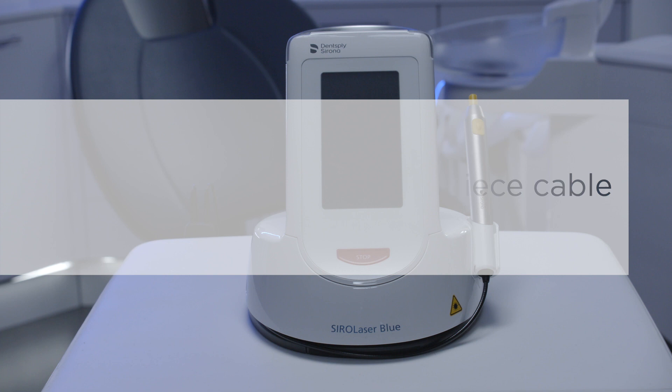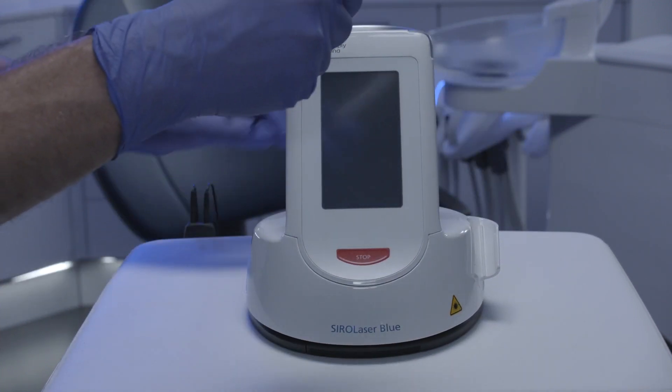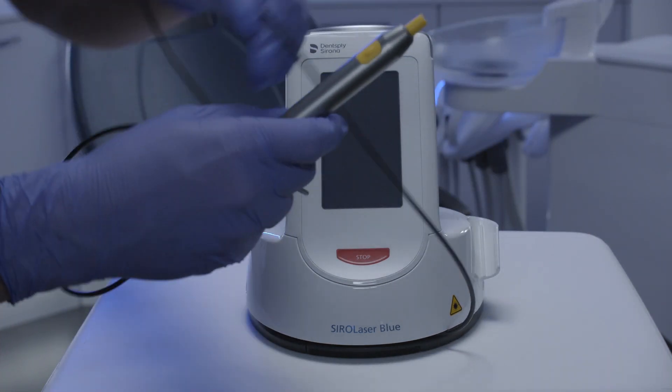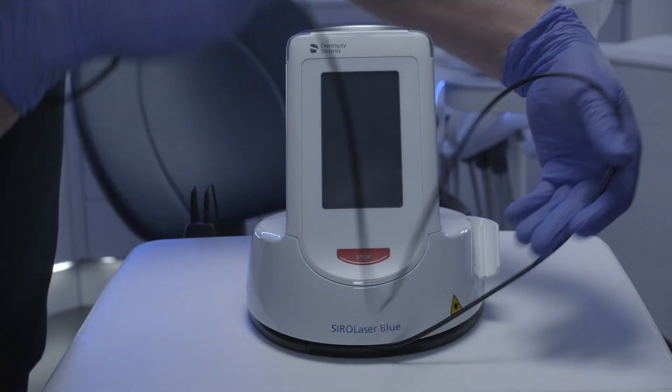Protection of the optical system also means taking care of the fiber inside the handpiece cable. You unwind the cable clockwise, and it must be wound up again counter-clockwise.